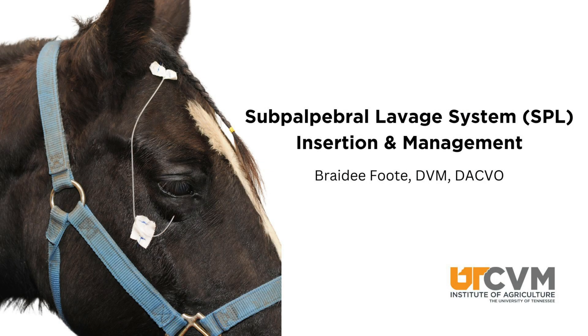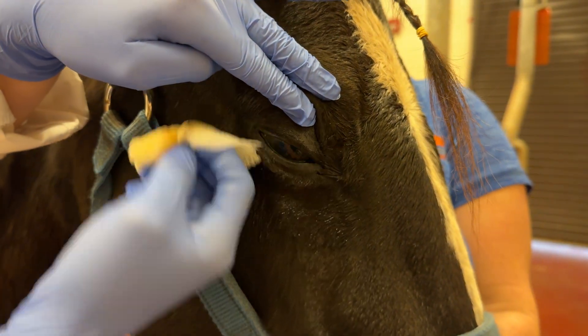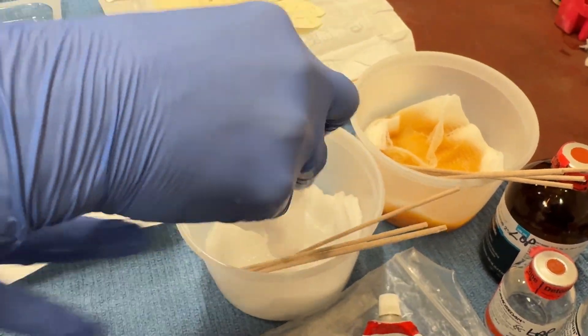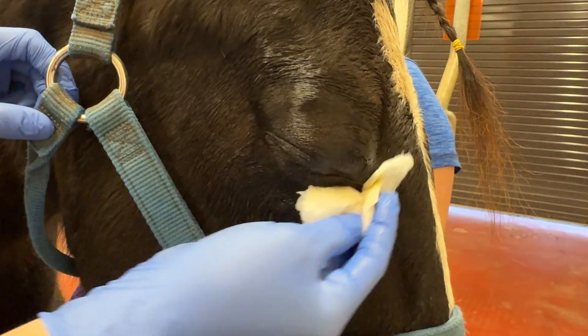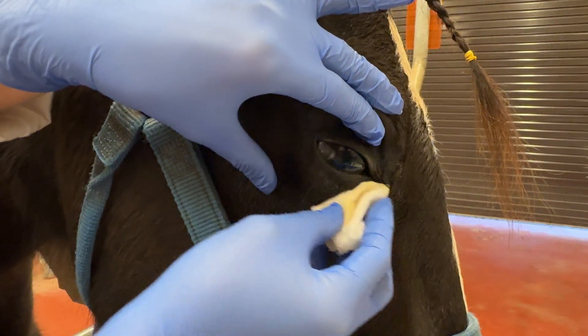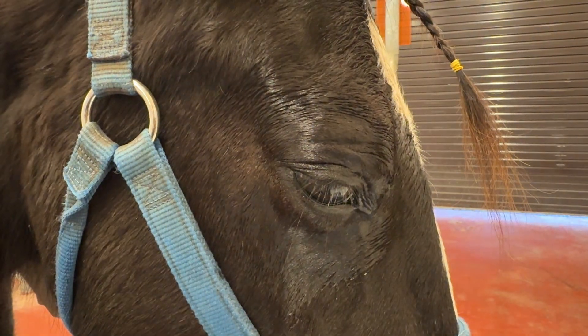We are demonstrating how to place a sub-palpebral lavage line in the lower eyelid of a horse. You go ahead and use saline after the dilute betadine in order to rinse that away so it's not irritating to the skin.